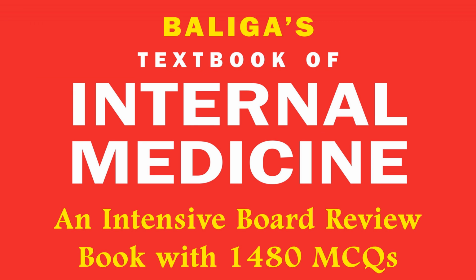None of the cardiac MR criteria was found to be associated with histopathology or major adverse cardiovascular events, leading the authors to suggest caution in reliance on late gadolinium enhancement or elevated T2 weighted STIR signal.